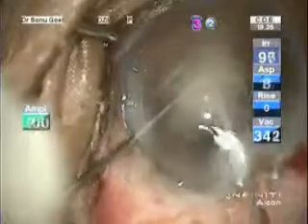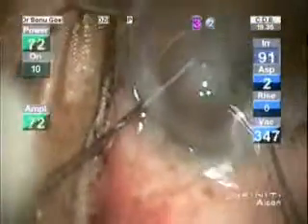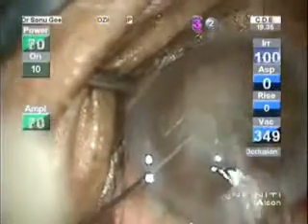As you can see here, this patient had a very bad cornea with a central band-shaped keratopathy. Despite all odds, a successful phacoemulsification can be managed and good vision can be restored in such patients. The band-shaped keratopathy now becomes quite obvious, and the lens matter can be taken up and the IOL sits in the sulcus.